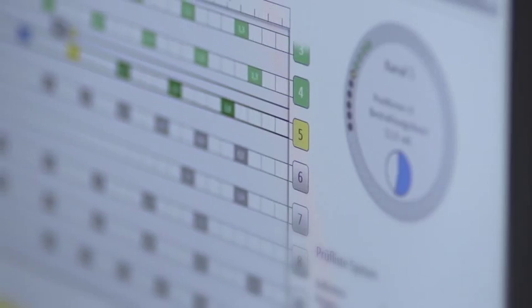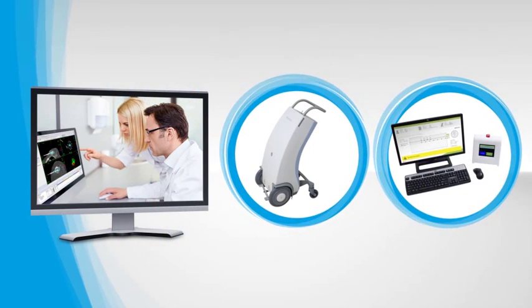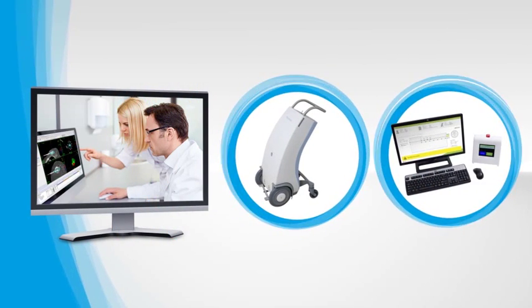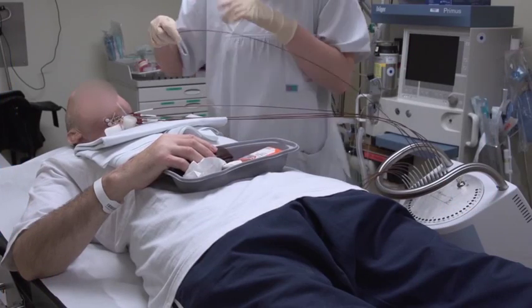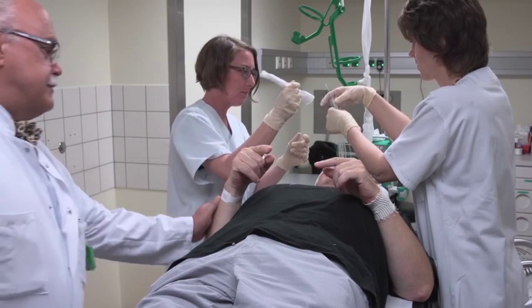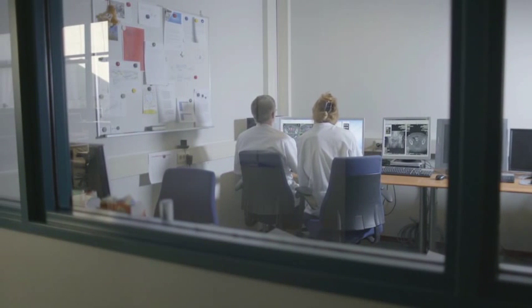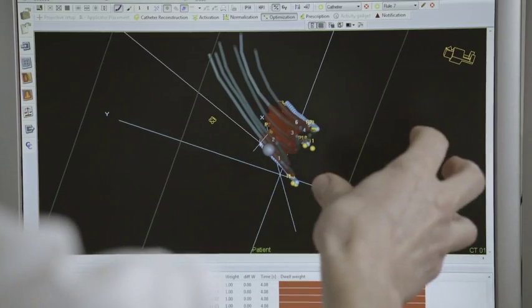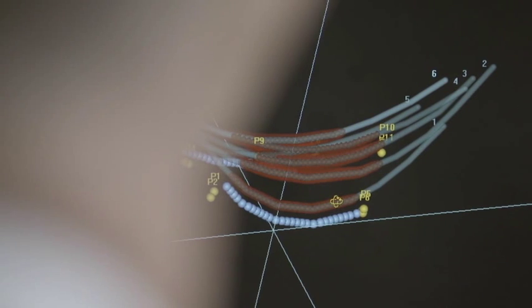When Oncentra treatment planning version 4.5 is used in combination with the new Flexitron afterloading platform, you will optimally benefit from a number of smart features that allow for an easy, standardized way of treatment planning while feeling confident about accurate and safe treatment delivery. The key to creating a great treatment plan and consequently designing the optimal dose distribution is to work as accurately as possible. The imaging and the data set have to meet clinical reality as closely as possible. Reducing the chance of making mistakes is very important.